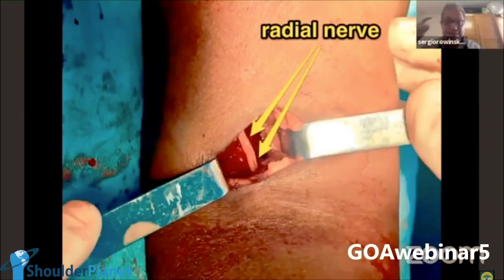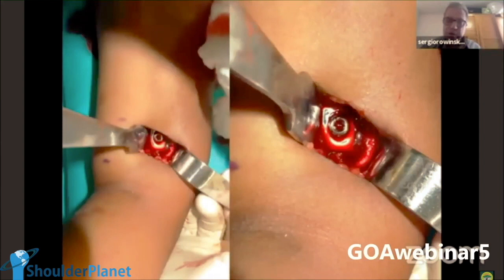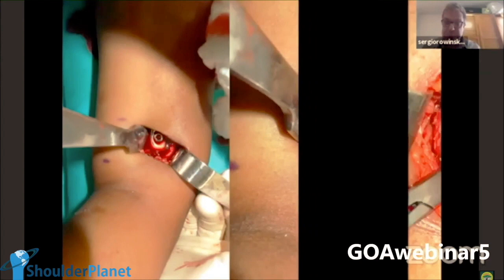This is another case, a left shoulder and arm. And at the end of the surgery, many times the nerve is very close to the inferior part of the plate. It doesn't matter. This is another case, and so on and so on.